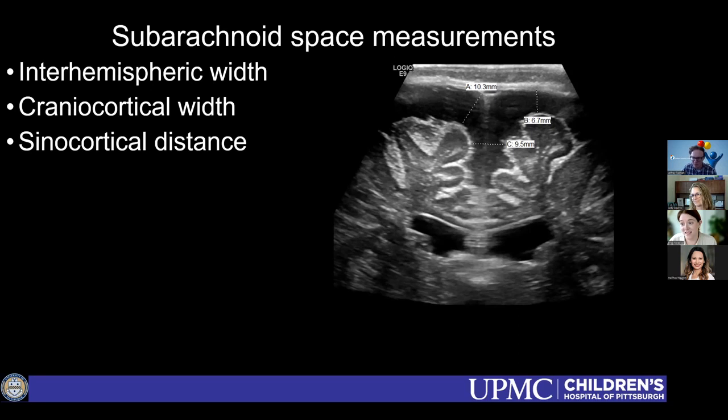Yeah, this is another one of those where it'd be really nice to look back at all of this now with more modern machines. If you look back at the types of ultrasound machines and images that we were getting when we were making a lot of these rules, our imaging has dramatically changed, and the structures that we can see are significantly better. It'd be interesting to go back and really relook at all of this with the new technology that we have.